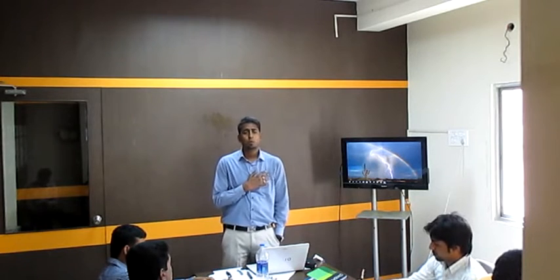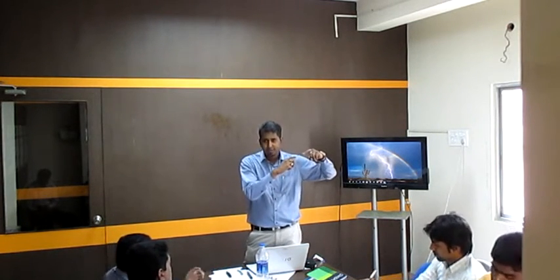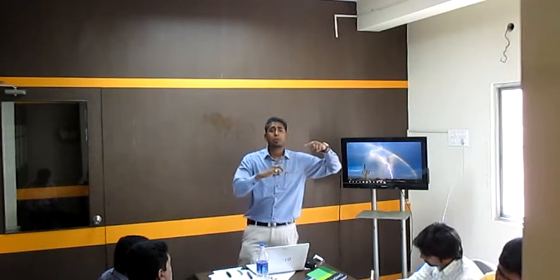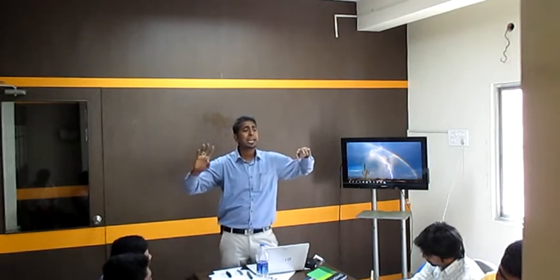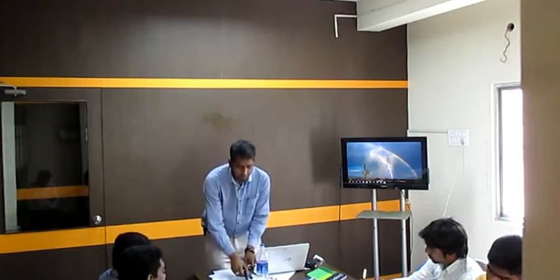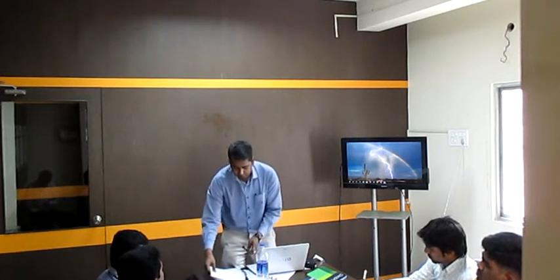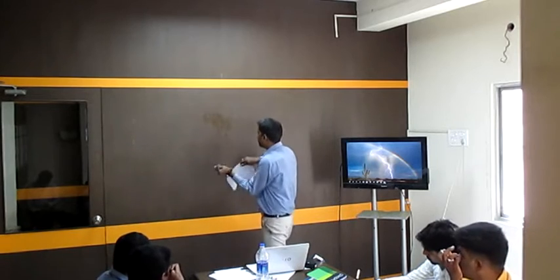1:1 means the speed of micromotor will be the same as the speed of your burr. Or you can say the speed of burr will be the same as the speed of your micromotor. 1:1 means what? This ratio shows.